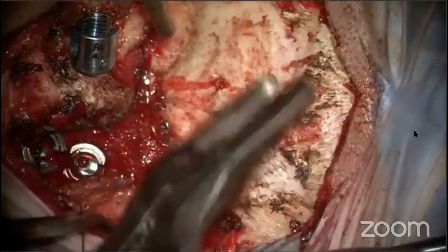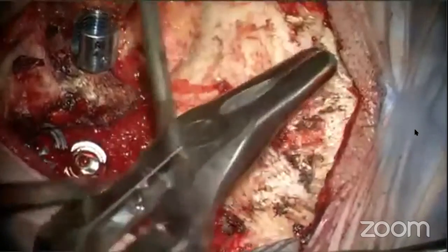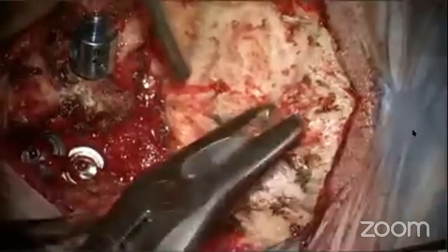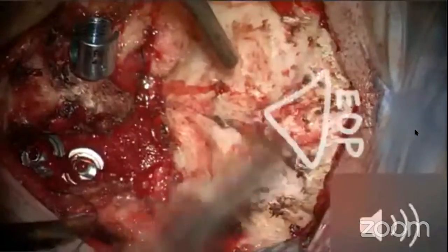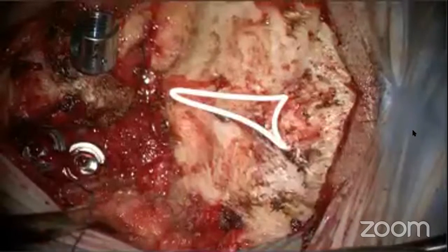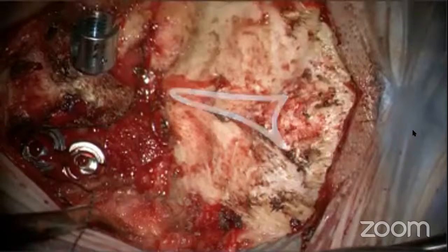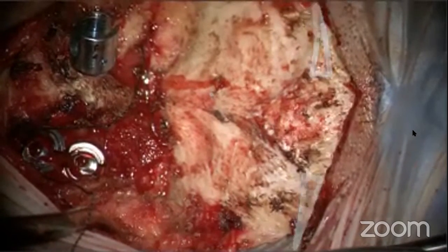The surgical exposure and insertion of the cervical screws has already been done. To the right is the occiput. I am a left-handed surgeon standing on the right side of the patient. Here you can clearly see the external occipital protuberance. That is the midline keel or the crest, which will be the thickest part below the EOP. The superior nuchal line runs horizontal on both sides of the EOP.